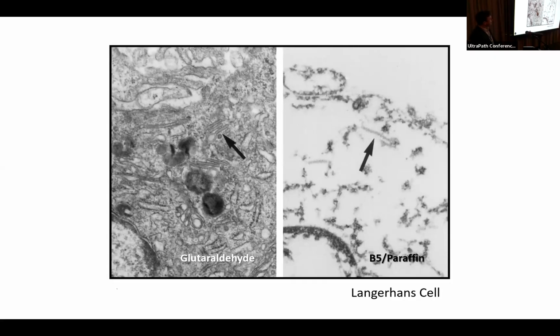And I would caution that mistakes or misinterpretations, or maybe sticking your neck out too far, should not be done on any tissue that's suboptimal. That's when you start getting risky. Knowing in this case that we're looking at Birbeck granules, which is a pretty solid structure that's going to hold up well to poor fixation, you can do a little bit more than you can if you're looking for mitochondriopathies or something like that, for example.